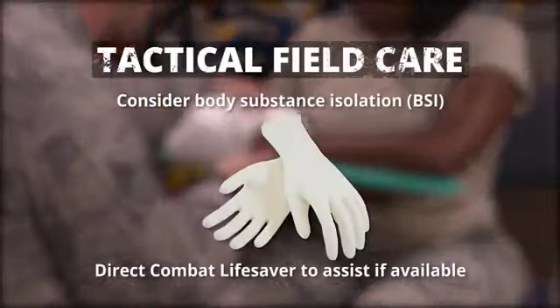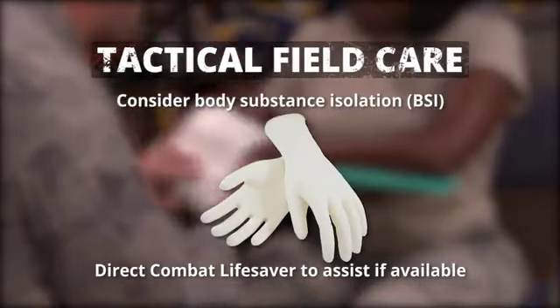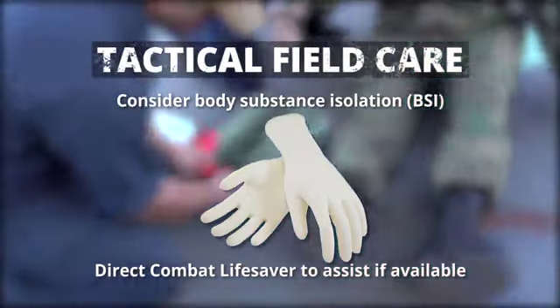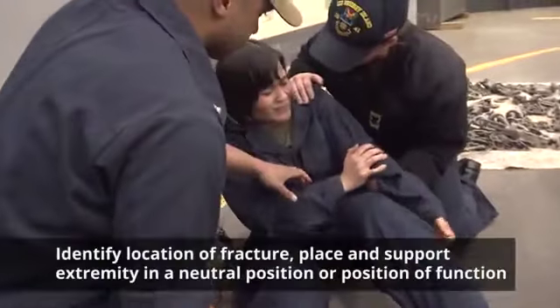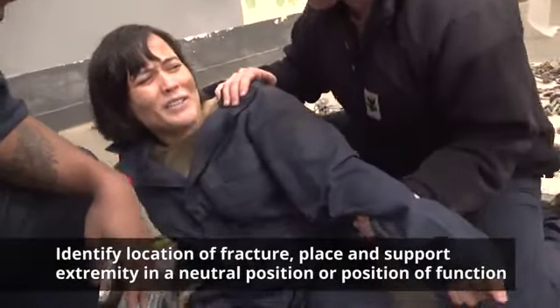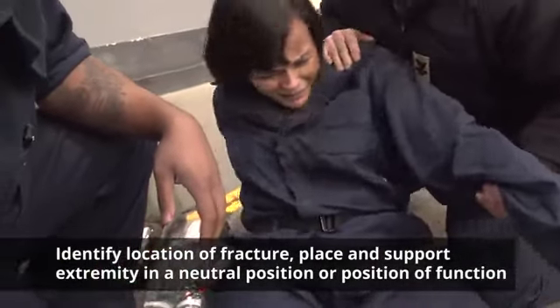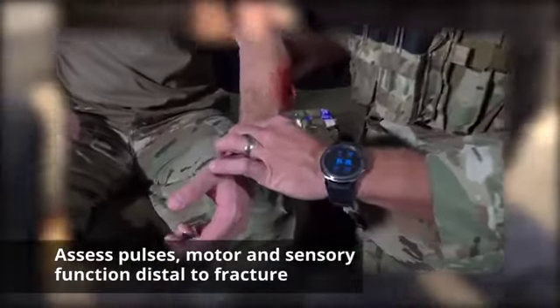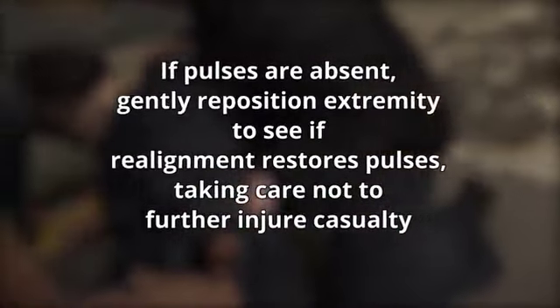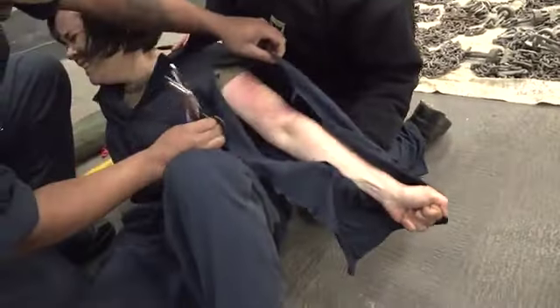When applying a splint, consider body substance isolation and have a combat lifesaver, or CLS, or other responder help you whenever possible. Identify the location of the fracture and place and support, or have a CLS place and support, the extremity in a neutral position or position of function. Assess the pulses, motor and sensory function distal to the fracture. If pulses are absent, you may gently reposition the extremity to see if realignment restores the pulses, taking care not to further injure the casualty.